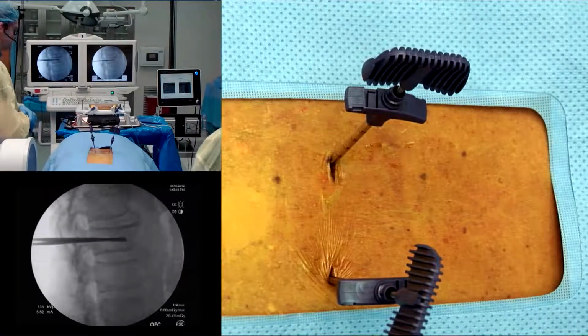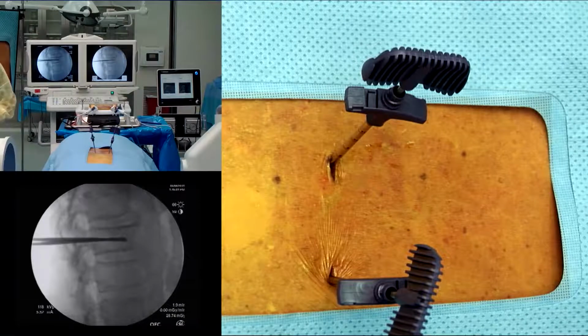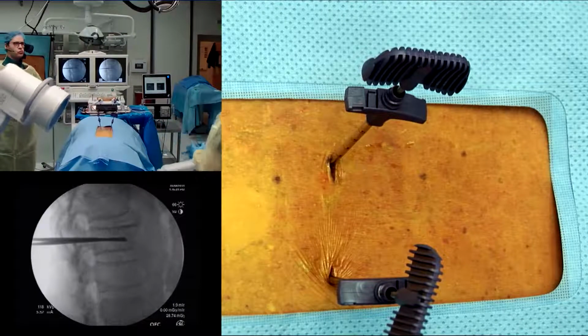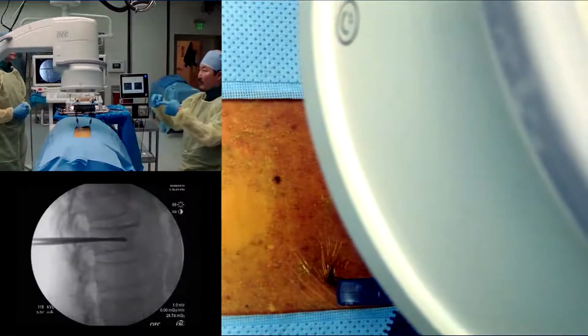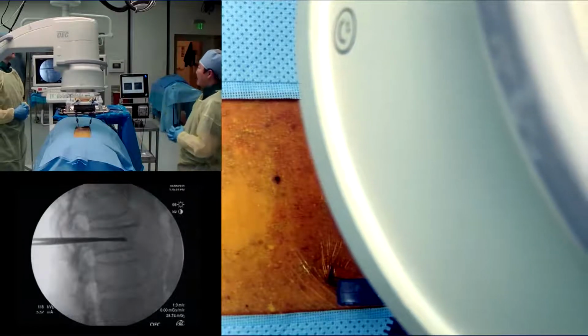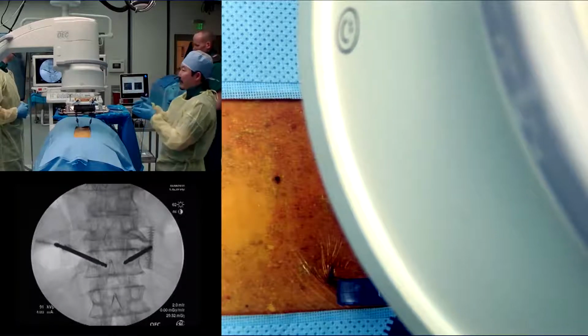Good. And then go just straight to 90 degrees AP. So we know we're anterior enough now. So we're going to want to get a better sense of where we're at with respect to the medial lateral, because we want to be converging, but we don't want to be so close that our balloons are going to be touching each other. If it is, it's okay. But that looks great. They're converging together.